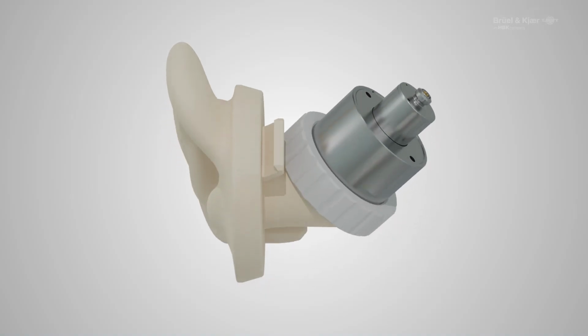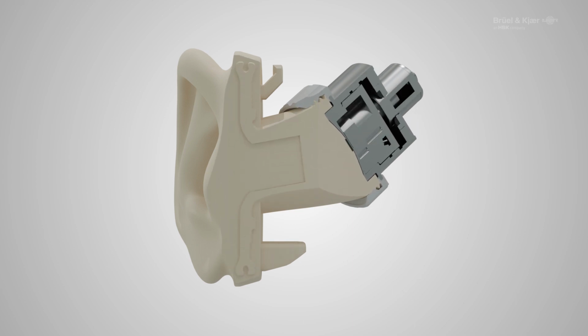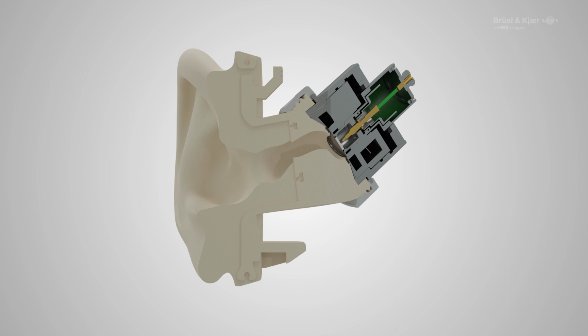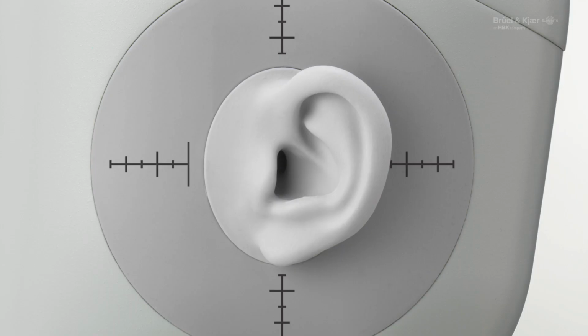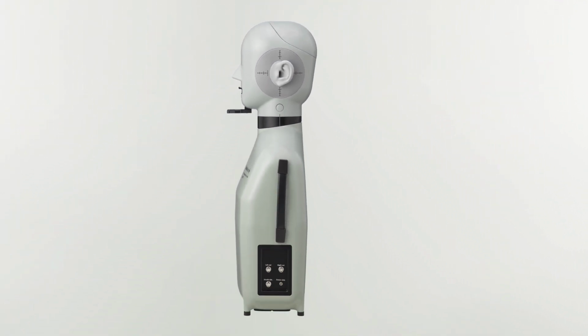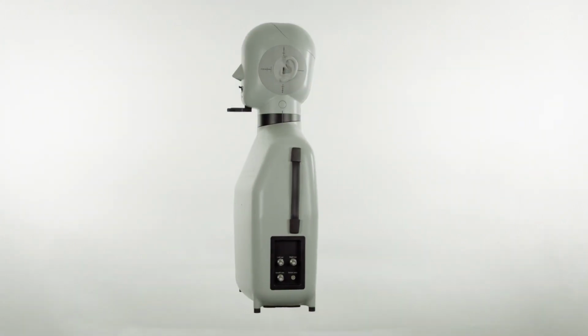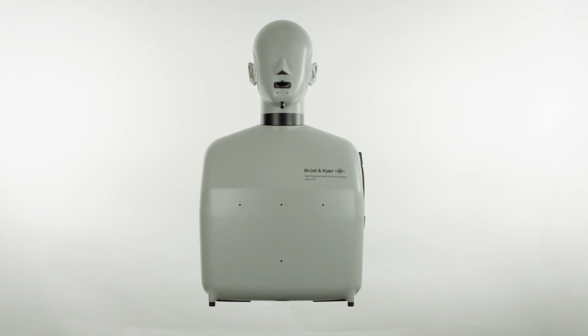The final step in the puzzle was to tune the open ear response and integrate into the hat structure. The pinna geometry was carried across from the version standardized in ITU P58, but to match the frequency and damping of the earlier standard, the concha had to be increased in depth slightly. The final result is a new design of hats that can accurately measure the response of near-field audio devices to 20 kHz. Almost as importantly, the human-like ear canal geometry can more effectively test in-ear devices fitted correctly.